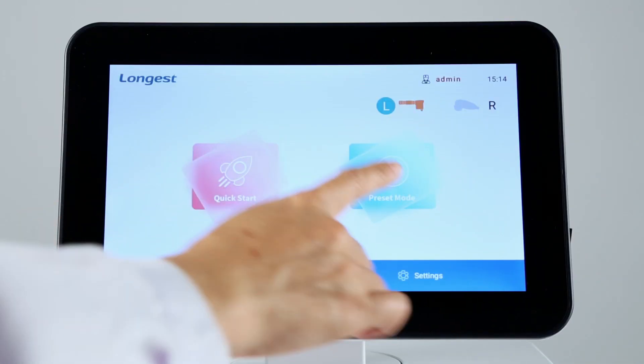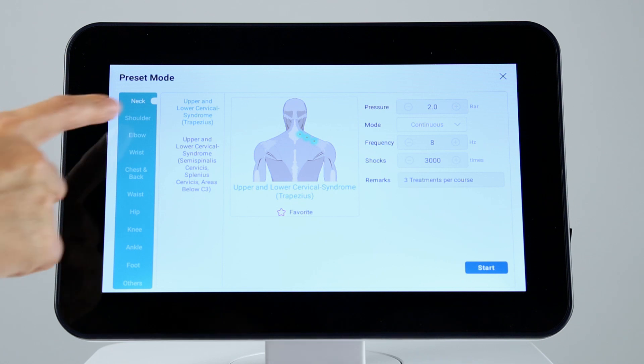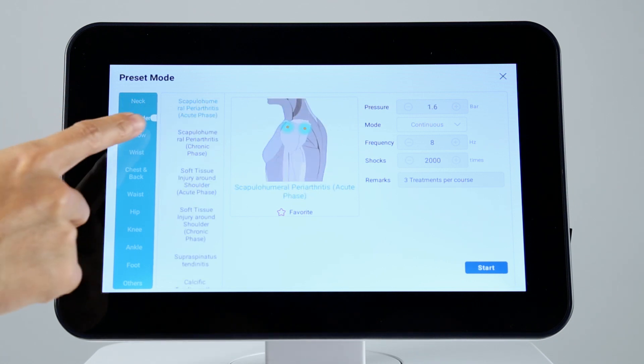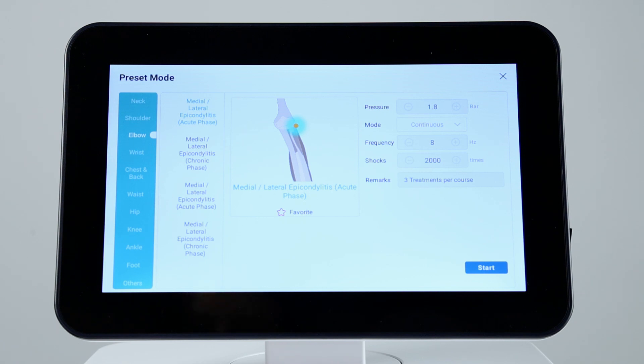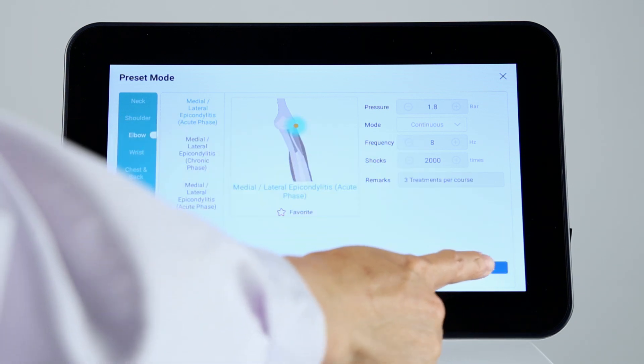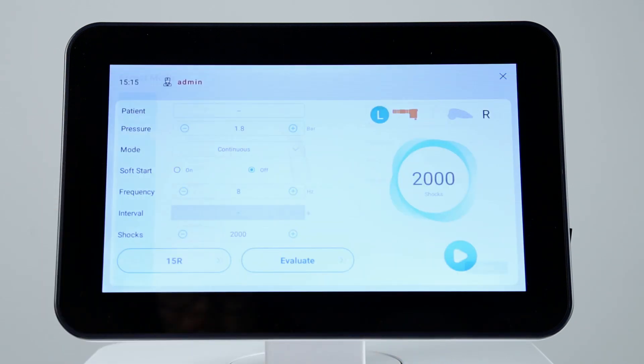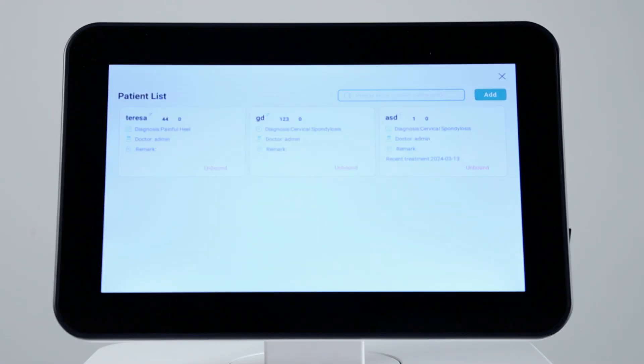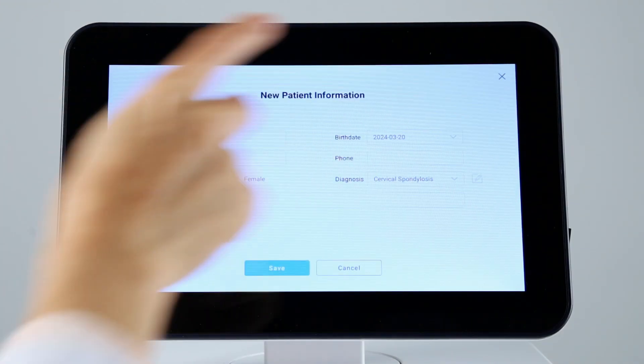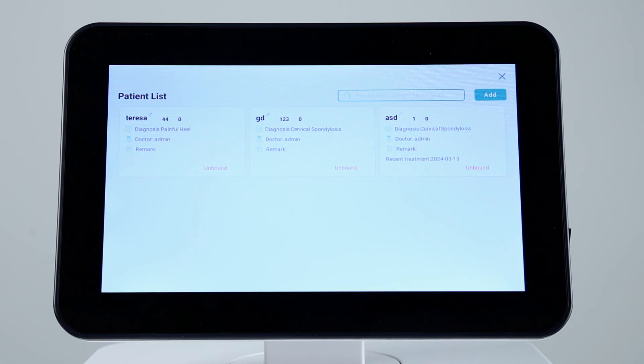Click the preset mode button to enter the protocol library. Select the appropriate protocol for a particular condition. Then click start button. Click the box of patient. You can bind the previous patient information or add new patient information.